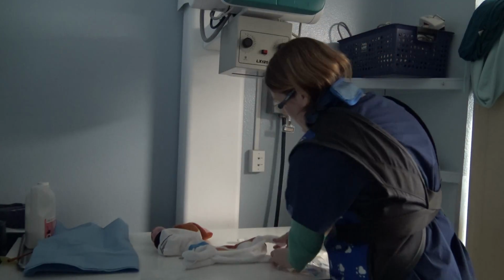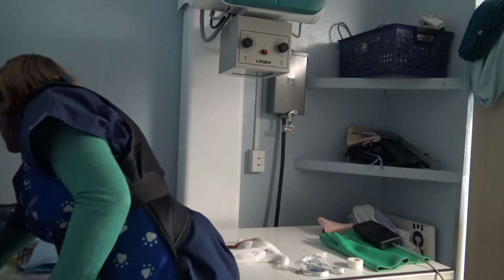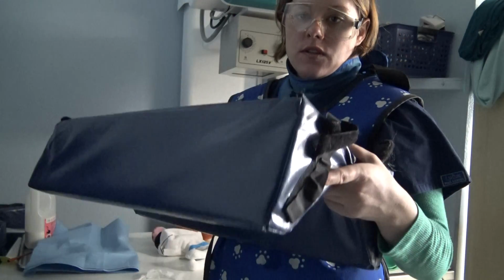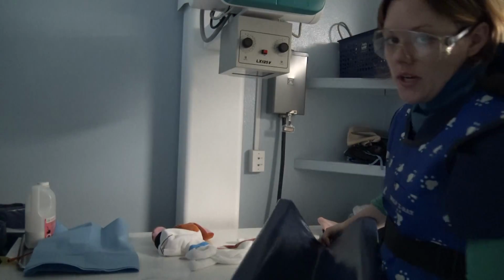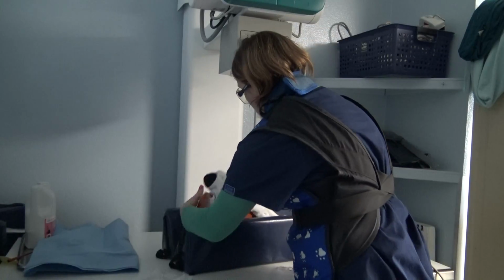For the VD, here we typically will use a trough if we're not restraining, or sometimes when we even are restraining, because it helps get them in the best position.